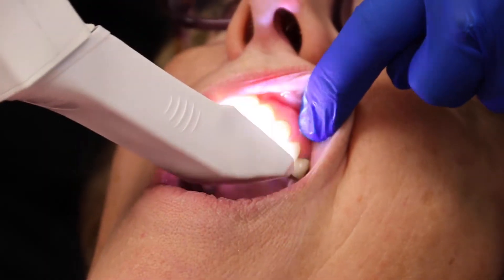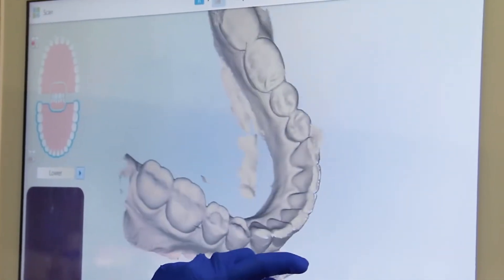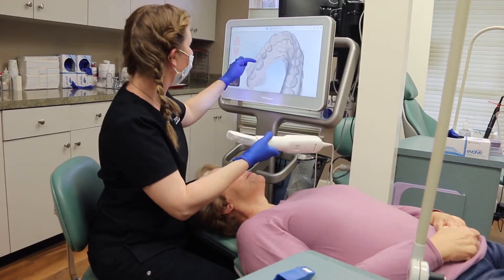My name is Michelle Baker. I take the three-dimensional scan of the patient. We send it over to our computer where we'll edit it and then we send it to the printer.